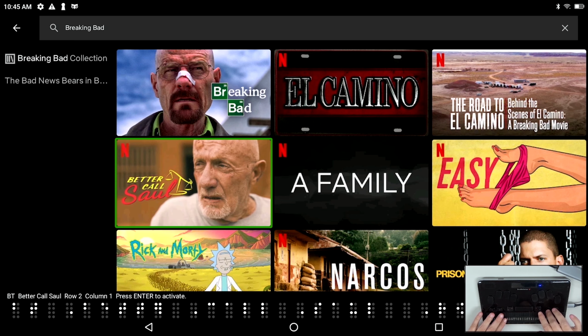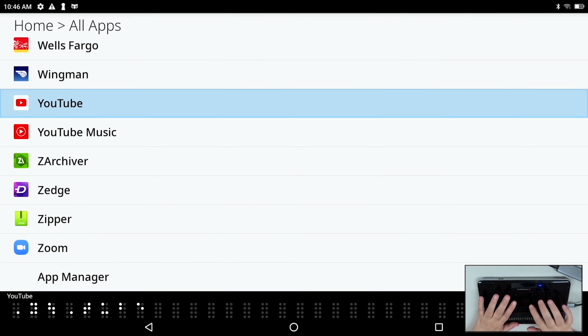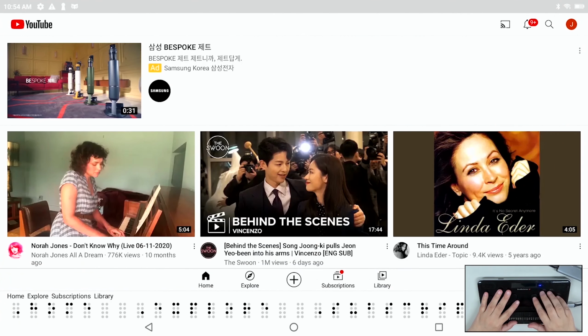So again, very, very simple and very quick. All right, let's take a look at YouTube. So I'm going to close this. Netflix. And I'll press the letter Y to go to YouTube. And I'll press Enter. List YouTube, home.